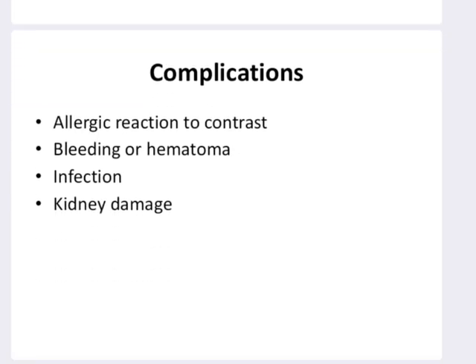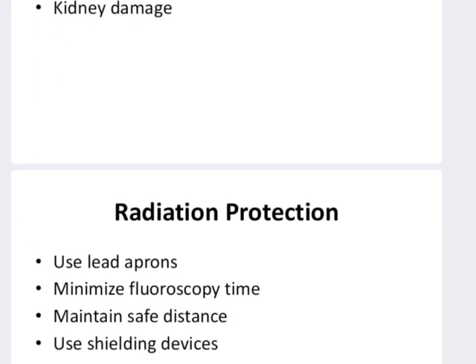And there are also complications over this angiography. That is, there will be allergic reaction due to the contrast injection to the patient. There may be bleeding or hematoma. There will be infection or kidney damages.